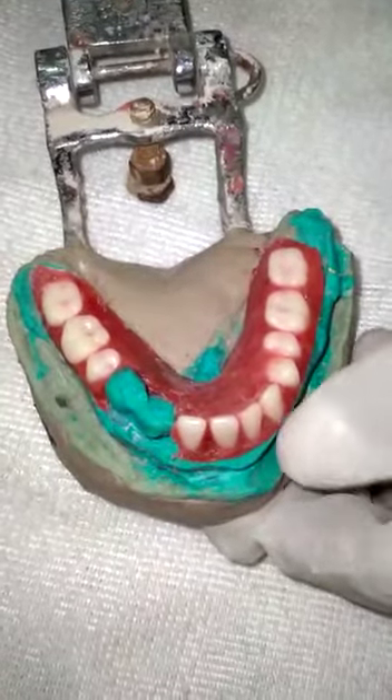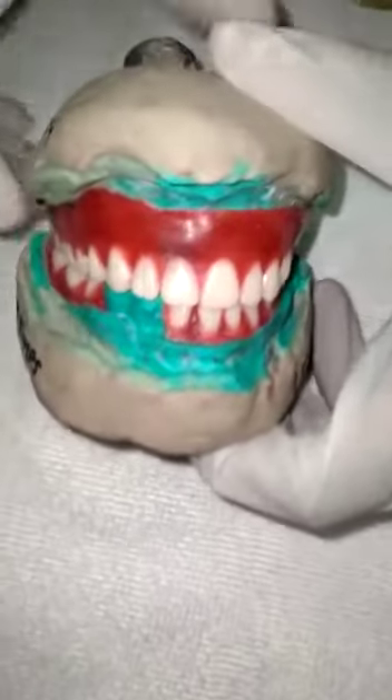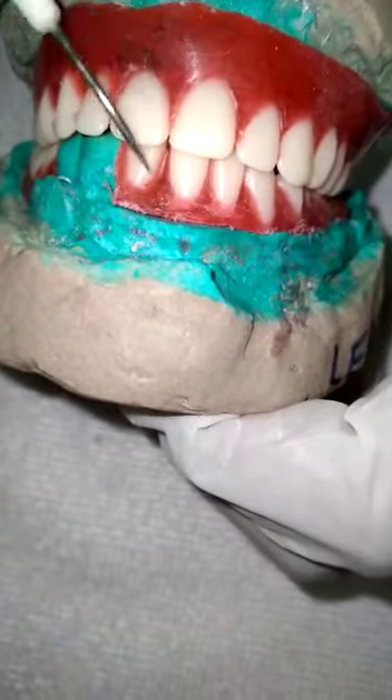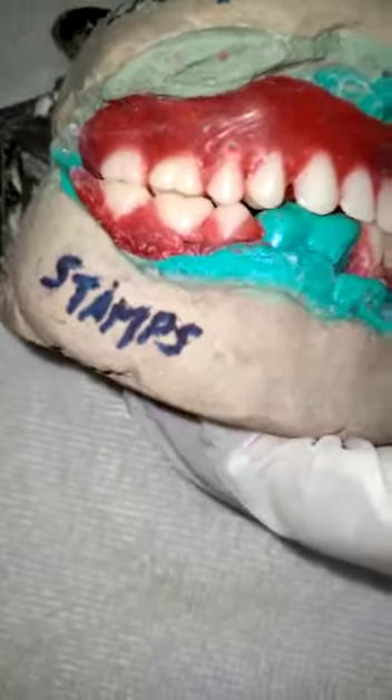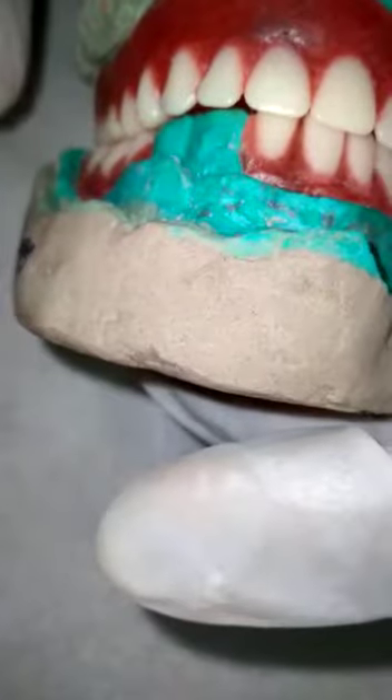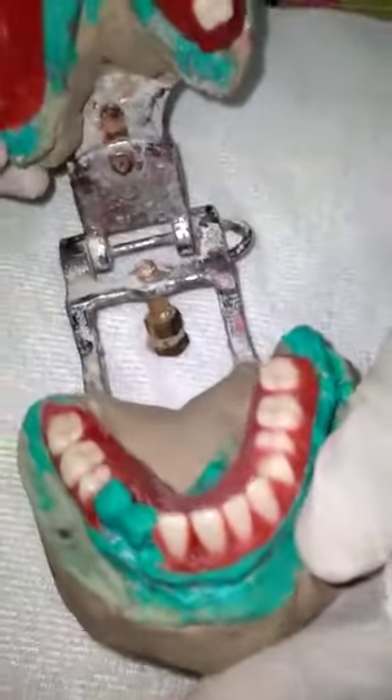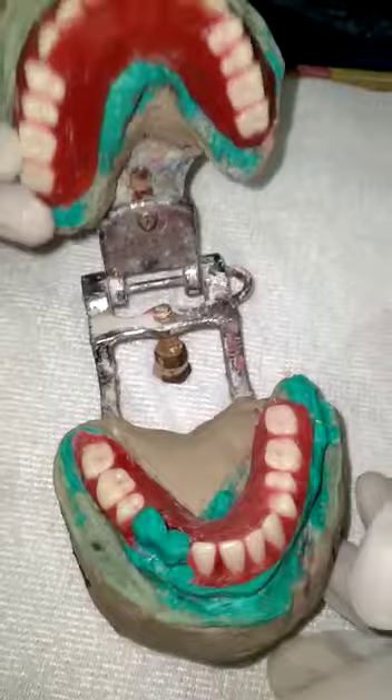This is the wax try-in. See the occlusion — I have tried to achieve the best occlusion I can. You can see the centric relation, the canine-molar relation, and the premolar and molar relation. I have tried to achieve all of this.